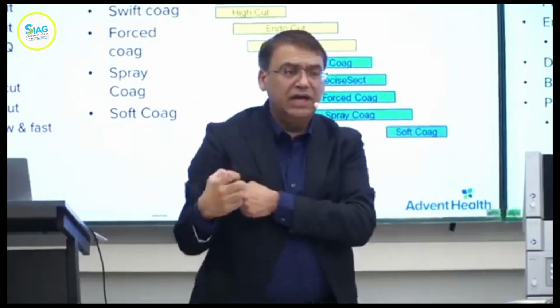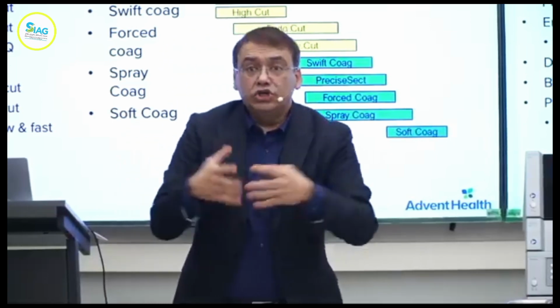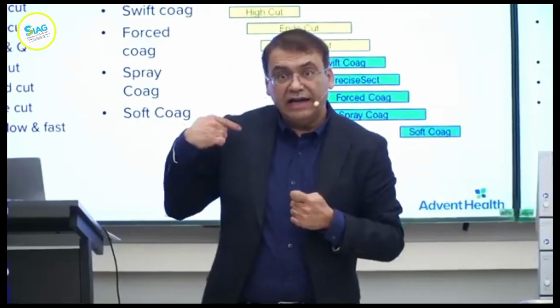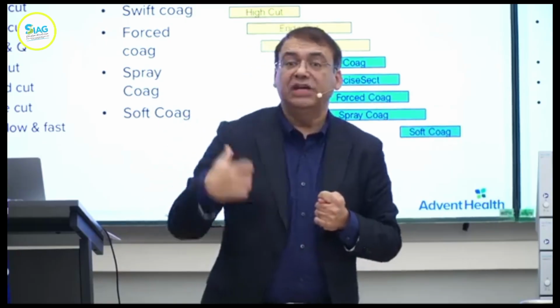Okay, so it should not be on bony prominences. It should be as close to the belly as possible, because you don't want to put it too far and the electricity has to travel that far to go back. Then there are more chances of causing a burn.